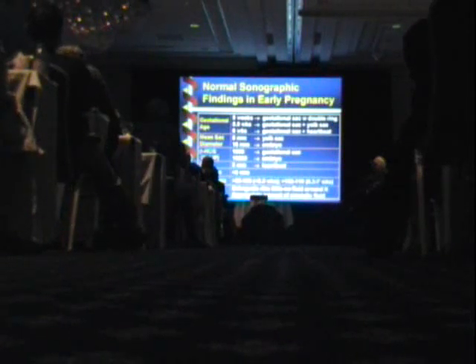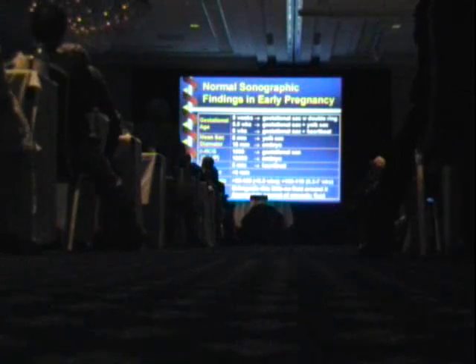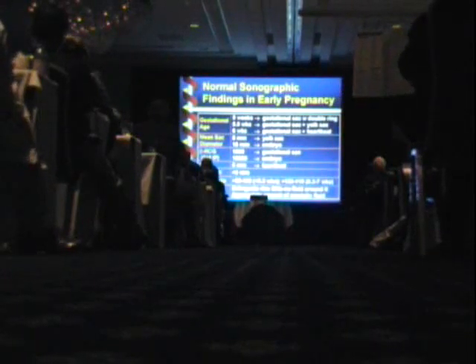So what does that mean? If you're looking for problems, if you have a pregnancy that you know is 6 weeks, 6.5 weeks, and there's no heartbeat, you're going to be worried. And we'll get into those in a minute.